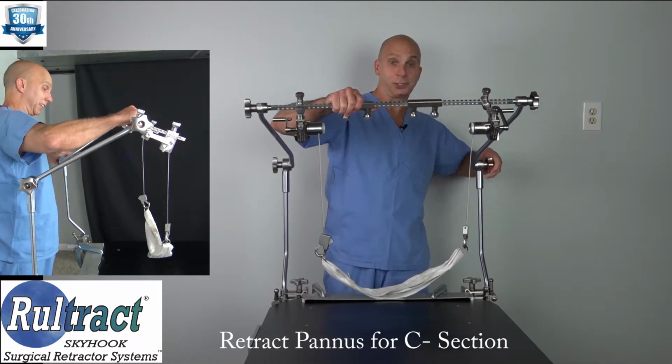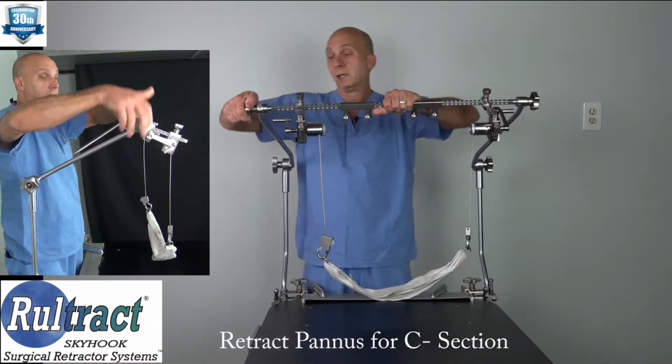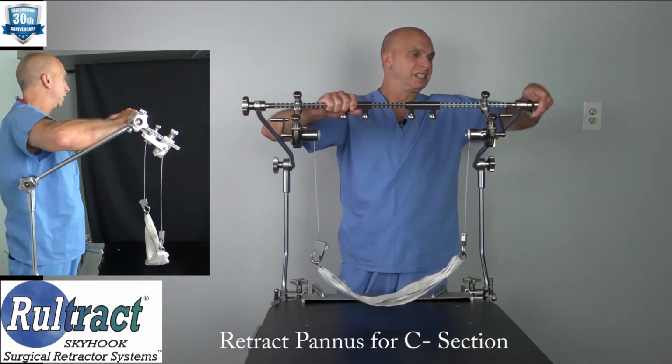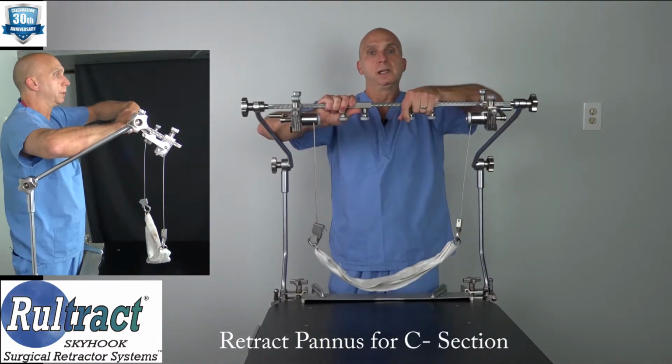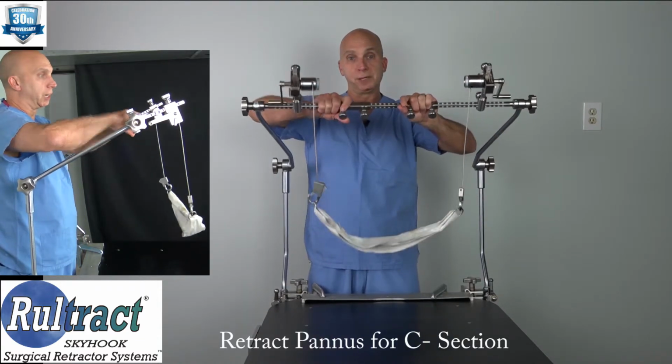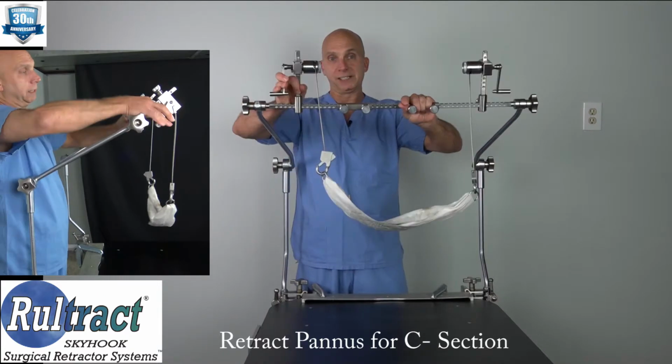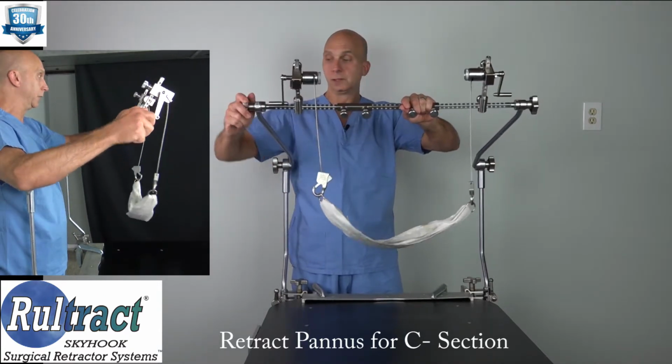I tend to make things look a little more complicated than they actually are. And if you had somebody on each side of the table doing this with you, it would help. You can adjust this up and even more out of the way if necessary, like so.